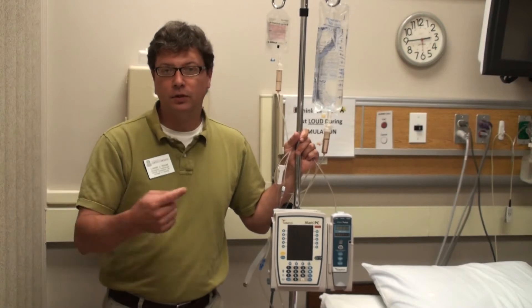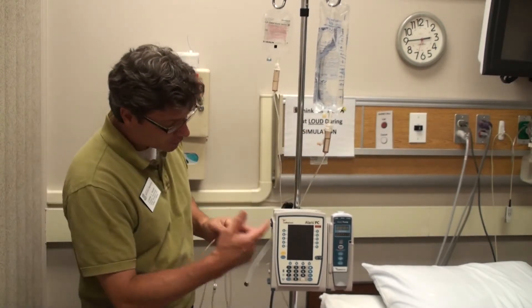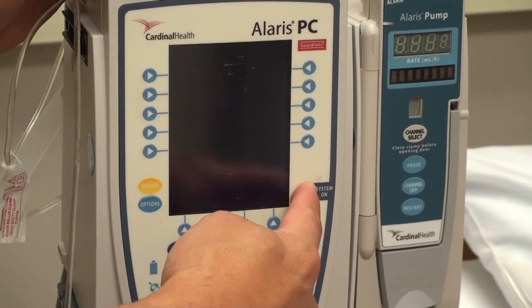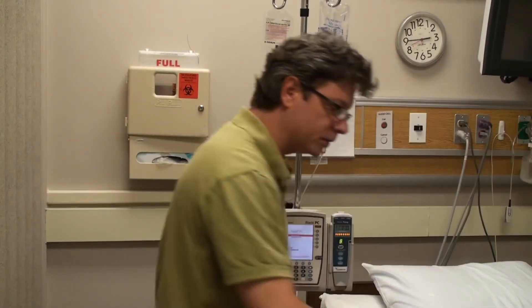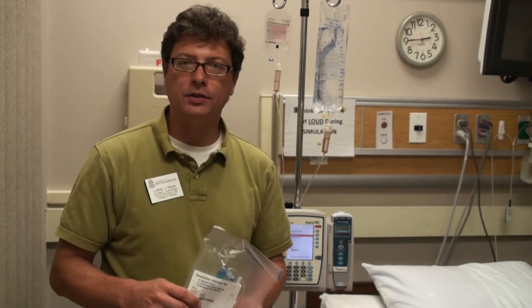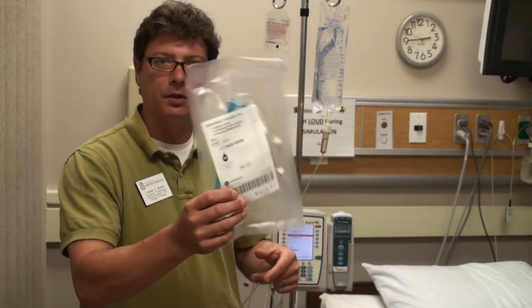For IV administration, we use the Alaris pump. To turn it on, the first thing you want to do is hit the system on button. While this is booting up, they use special tubing and this tubing can be found in the supply cabinet out by the nurse station. It comes in a little bag like this — you can open it up and use it.